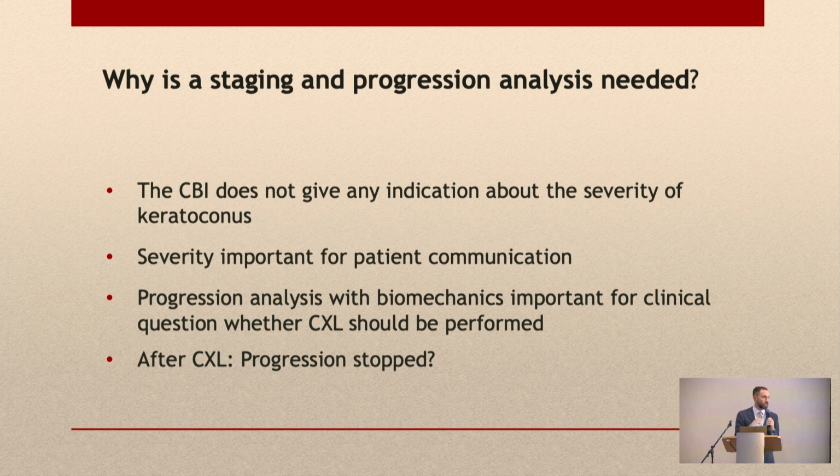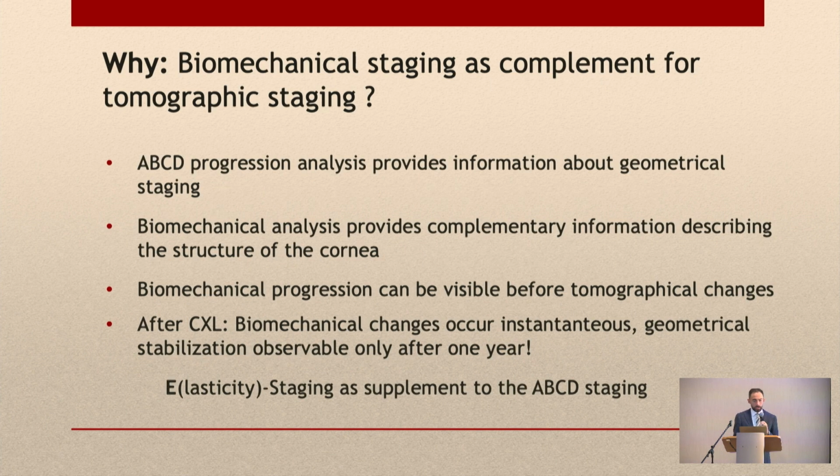The same thing is true for TBI and BAD-D. They are not designed to judge progression. They are designed to judge normal versus abnormal. So that is why it is important, in addition to the ABCD, to have something else that will judge elasticity or biomechanics.